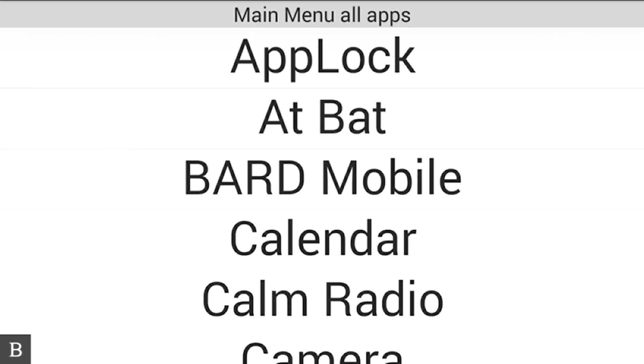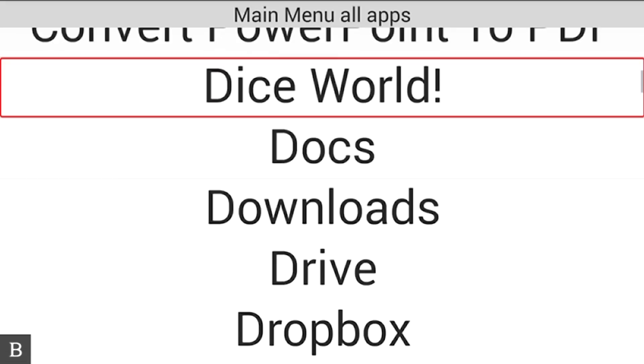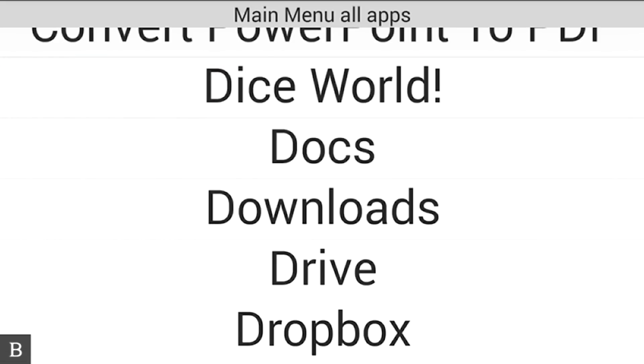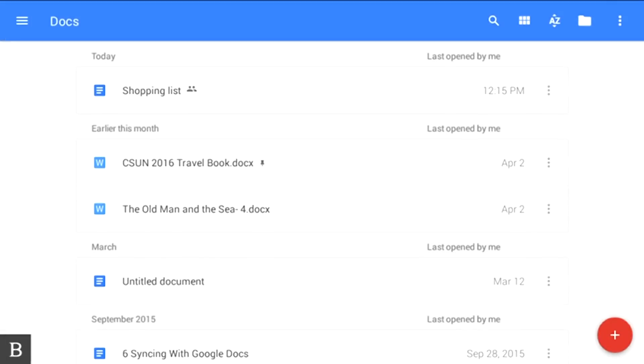I'm going to press D for Google Docs. D again - Docs. Now I'll press enter to go into Google Docs.